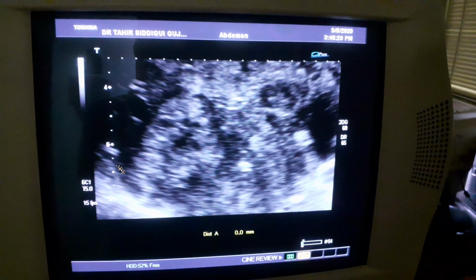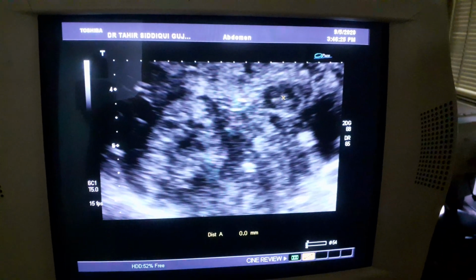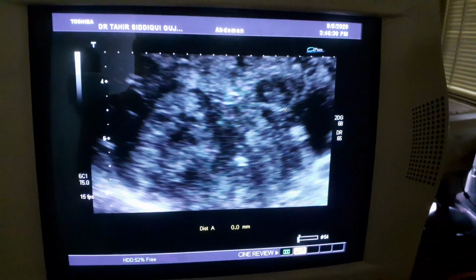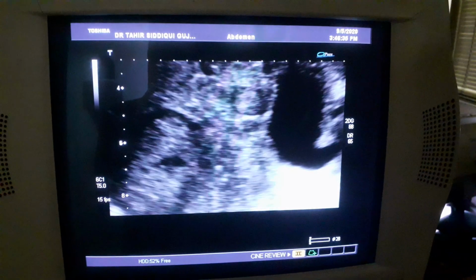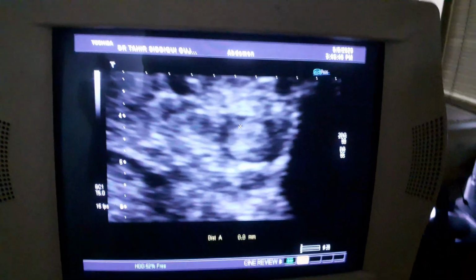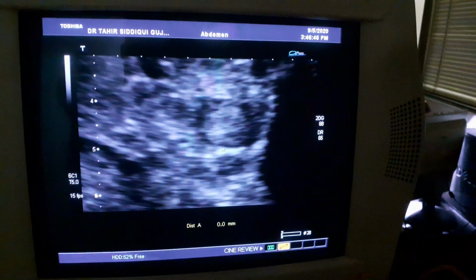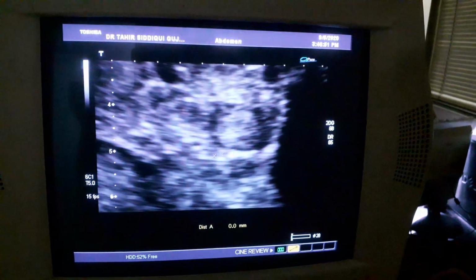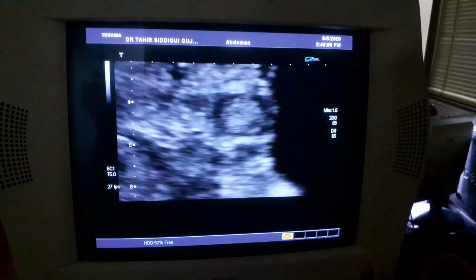So this is the diaphragm. Now this is in the posterior segment of the right lobe. This is another one with echogenic areas inside, but solid, no posterior shadow. All walls are seen clearly. There is another one with a clear-cut halo around it. This is an echogenic focal lesion, and see the black halo around it, a hypoechoic area surrounding it, no posterior shadowing. The echogenic area is well demarcated in this region.